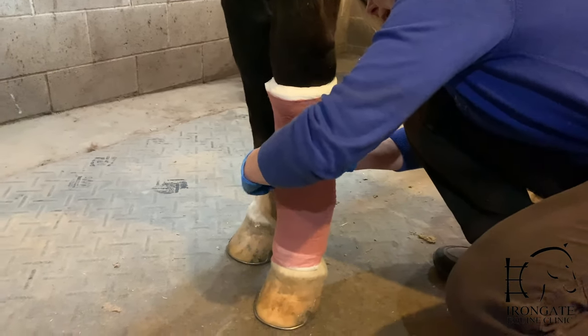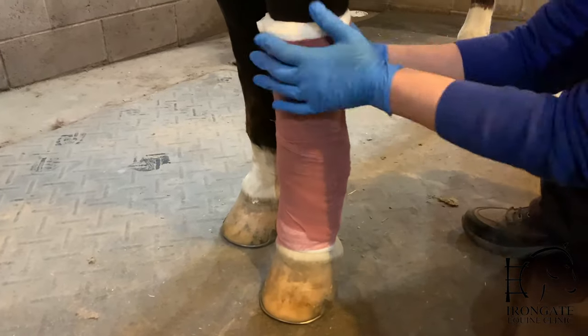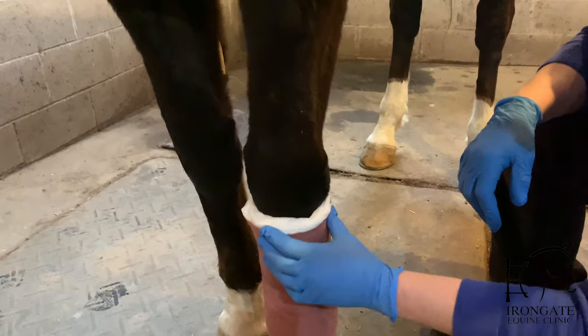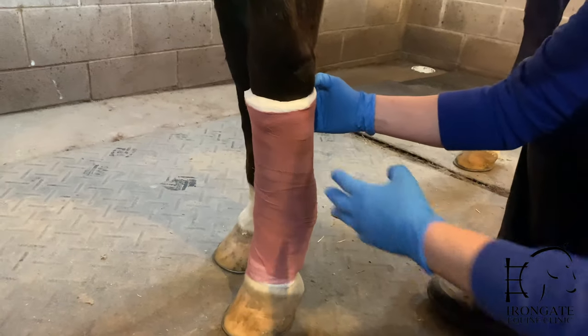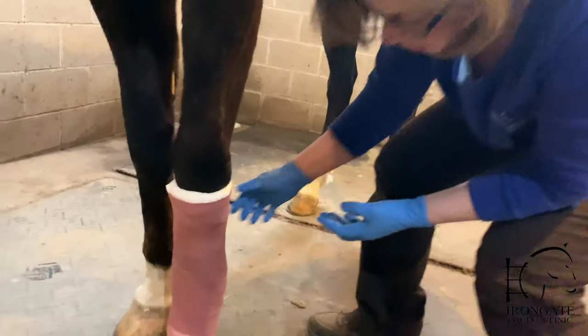When you get to the end, this gauze will just lay in place — you don't need to tuck it under. Now you've got almost a half an inch of padding over the tendons and the front of the leg where there's very little muscle, so that'll give you plenty of cushion so that you're not likely to get a bandage bow or injury.